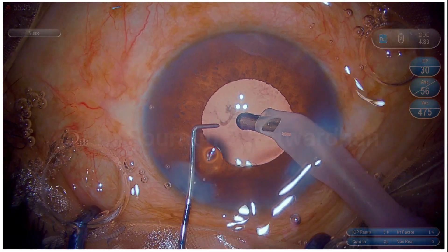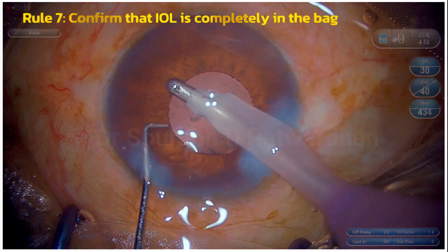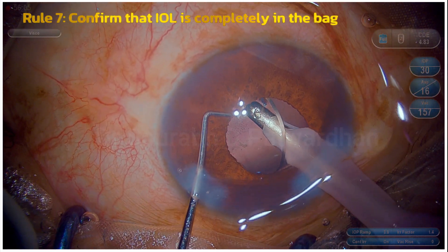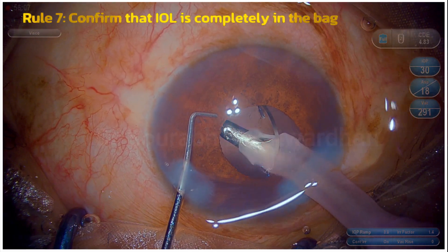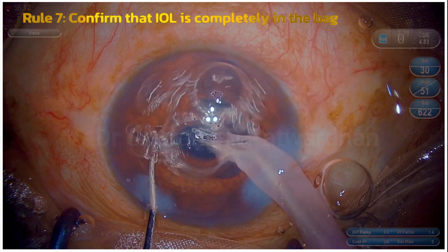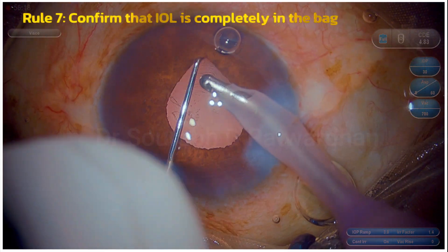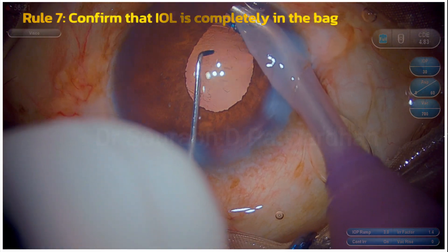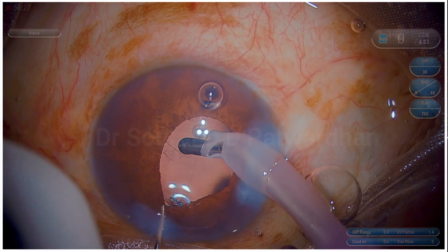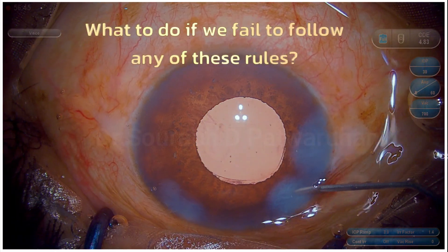It is very important that whichever type of IOL you use, you confirm before closing the case that the IOL is completely in the bag. Because the pupil is on the smaller side, you may not be able to visualize the haptics properly, and either both or one haptic might be in the sulcus rather than in the bag. You can verify by retracting the iris near the side of the haptics and checking that the anterior capsule edge is anterior to those haptics.